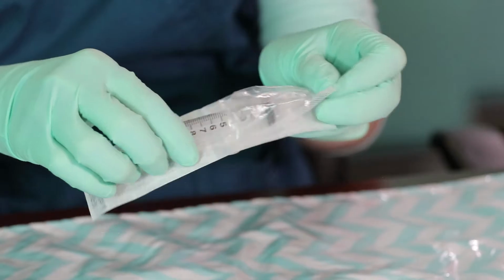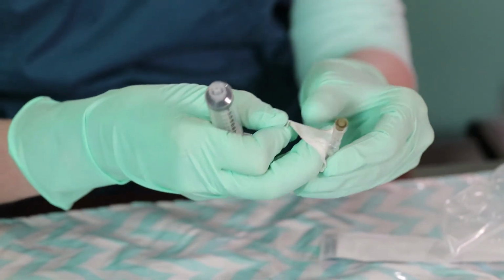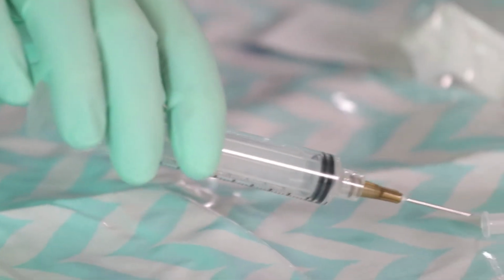Ensure proper technique when attaching needle to syringe. Do not touch critical sites. Peel and present when opening needle and syringe packaging. When reshielding needles, use the scoop technique or place directly into the sharps container.